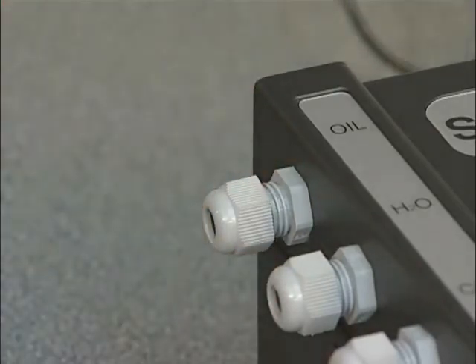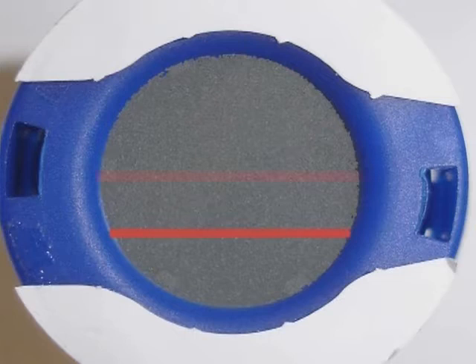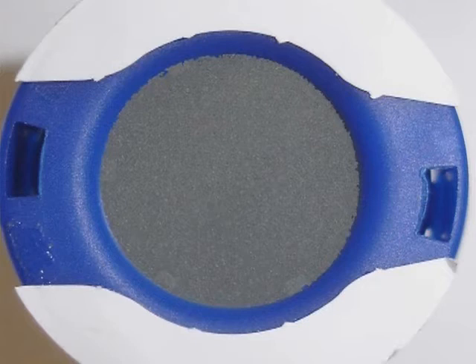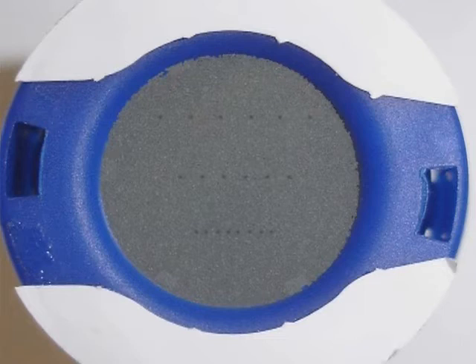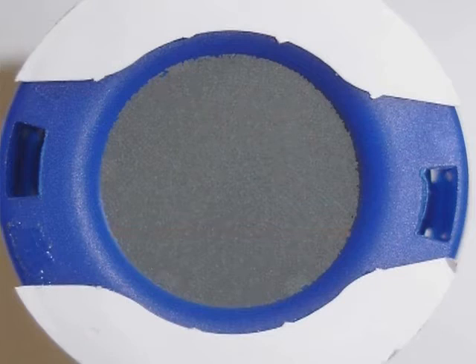Remove the impactor and peel off the protective seal. The impactor incorporates a series of three horizontal rows of nozzles. Any oil present in the air sample in aerosol form at a concentration level greater than 0.05 mg per cubic meter will be deposited on the display screen as a series of small dots. Each of the three rows has a different distance between nozzles and their spacing is calibrated to represent different concentration levels of oil: 0.1, 0.5, and 1.0 mg per cubic meter. When the dots on each row form into a continuous line, it identifies that the concentration level for that line has been exceeded. For this particular test, there are no dots present, so the oil concentration level is less than 0.05 mg per cubic meter.